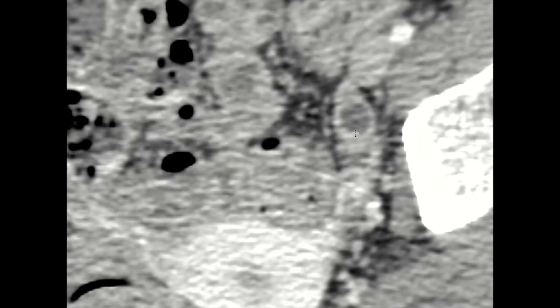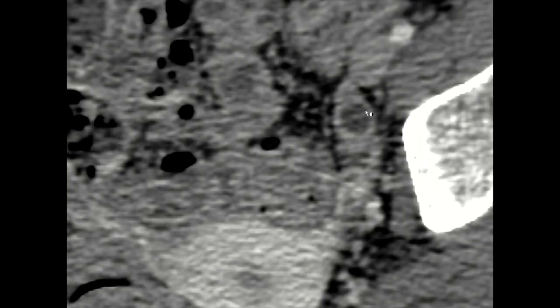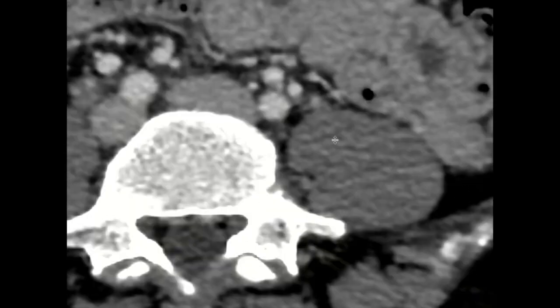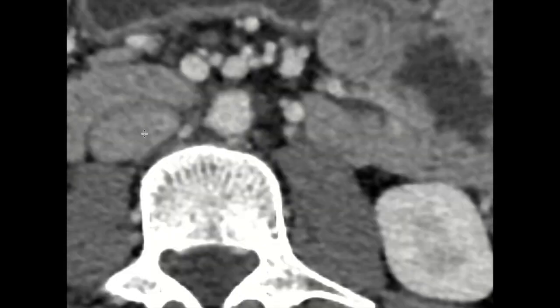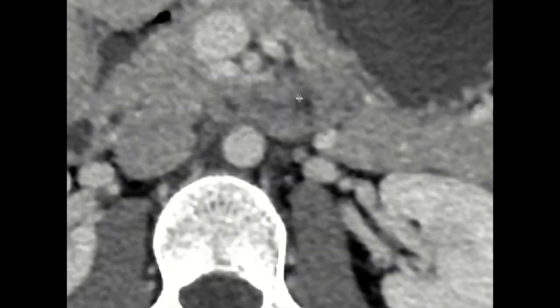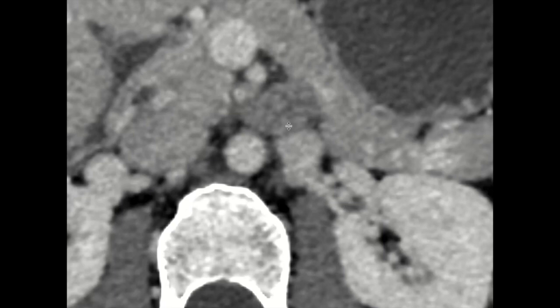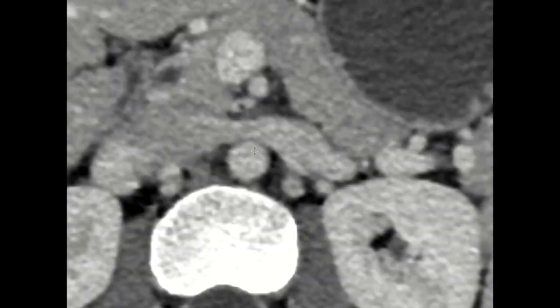You can see this little follicle within here — that's your left ovary. Following the vessel itself: on the right it's going to come off of the IVC, but on the left it's the vessel that comes off of the left renal vein that will help you identify the ovaries.